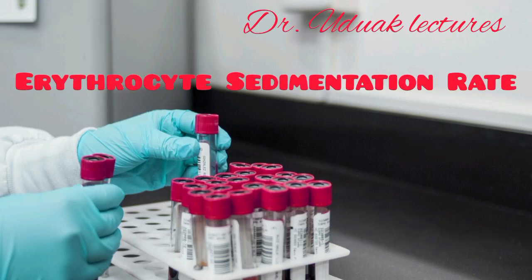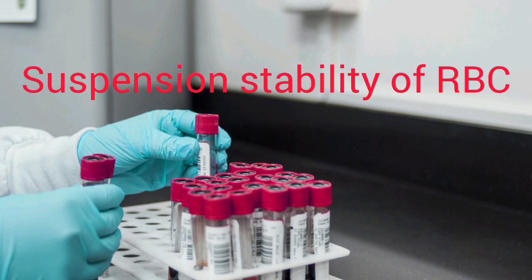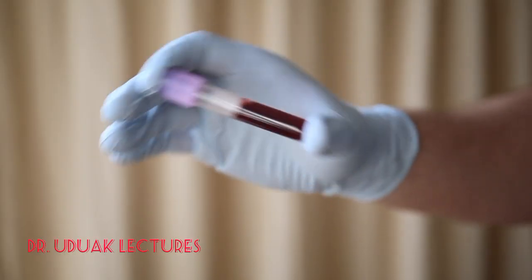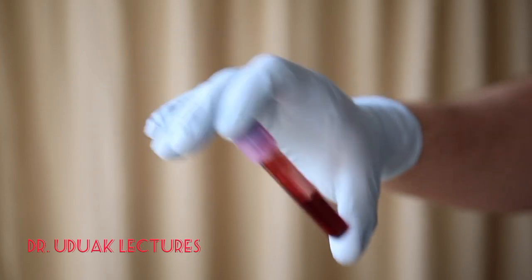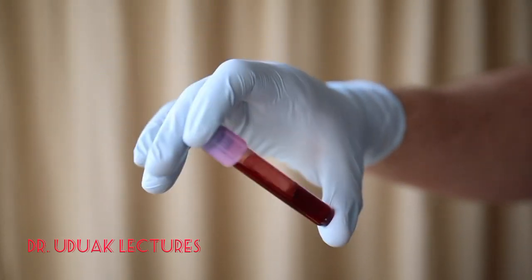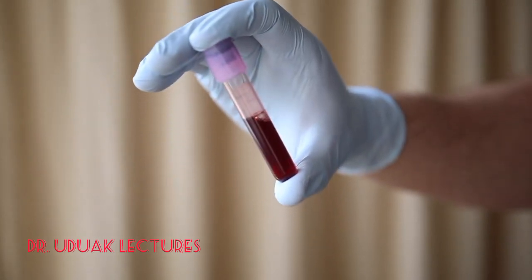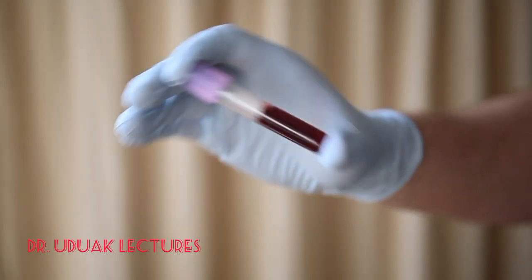Normally, the red blood cells remain suspended uniformly in circulation. This is called suspension stability of red blood cells. If blood is mixed with an anticoagulant and allowed to stand on a vertical tube, the red blood cells settle down due to gravity with a supernatant layer of clear plasma.